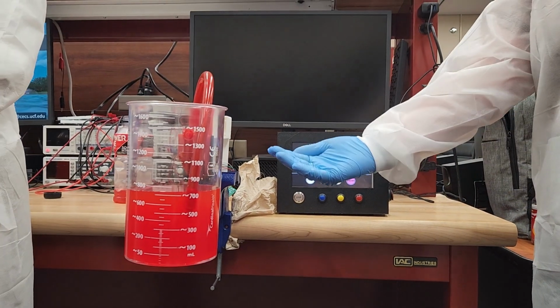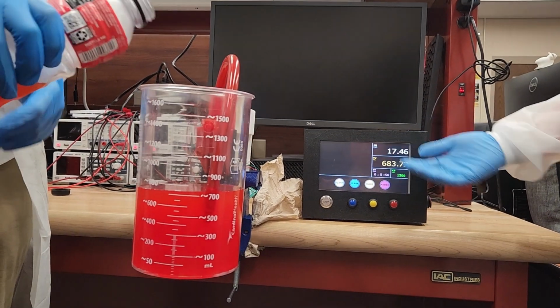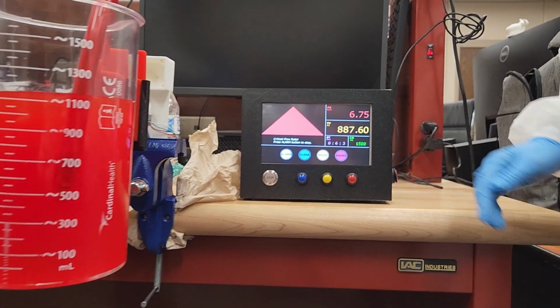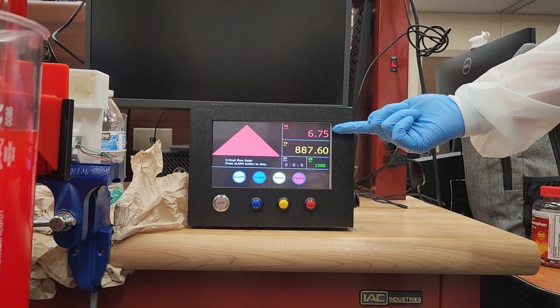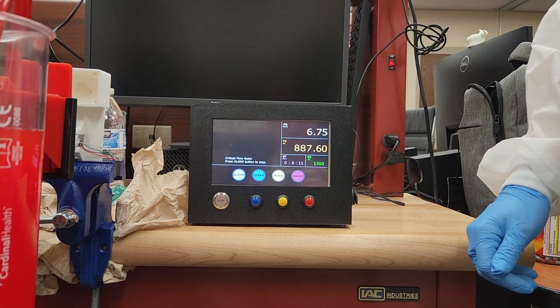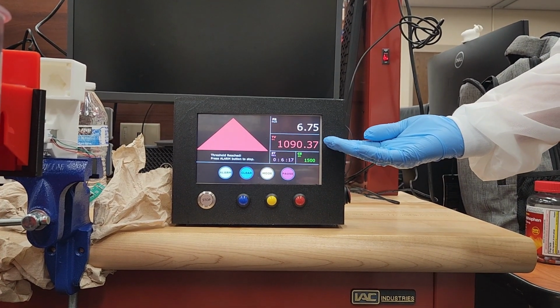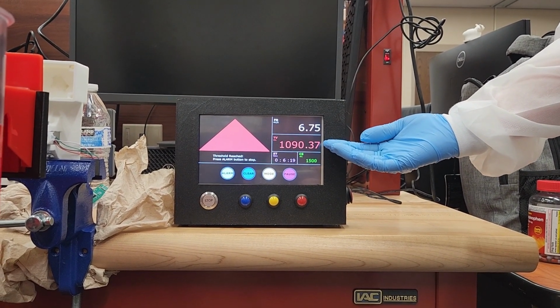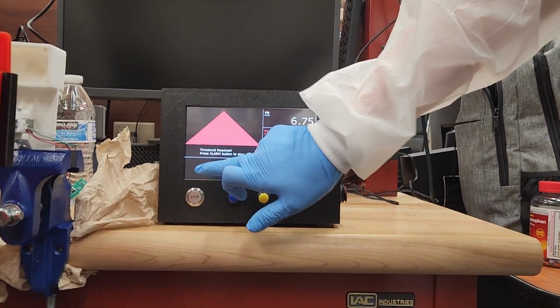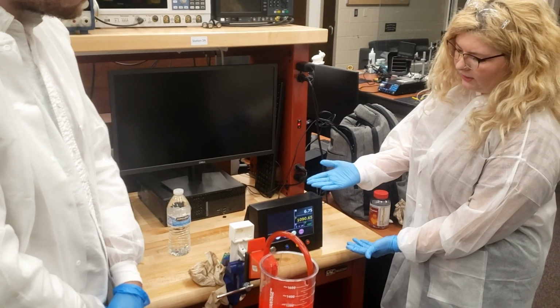We could add additional blood and meet our next threshold of the 1,000 milliliters, and the alarm will trigger again. We have exceeded the blood flow rate again, which is shown here. It has now alerted us that we are beyond the 1,000 milliliter threshold, which aligns to our canister. And that is the Bleed ID blood loss monitor.